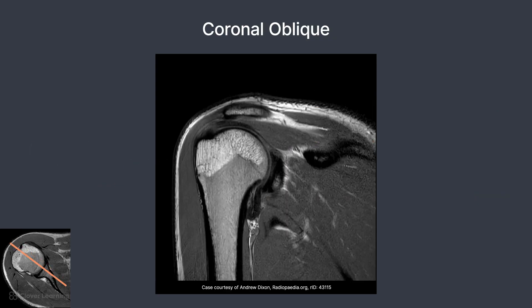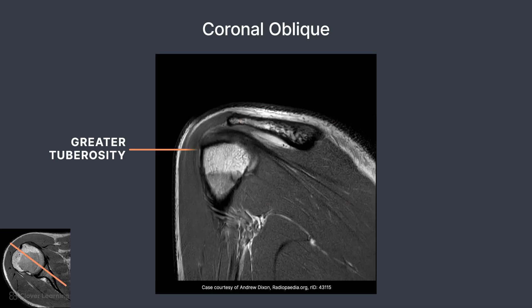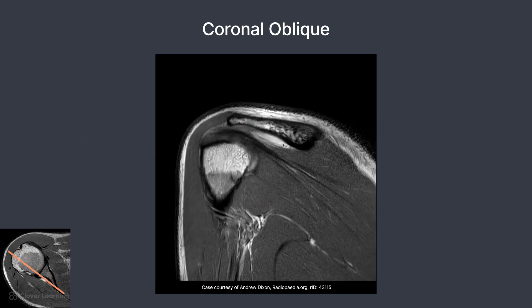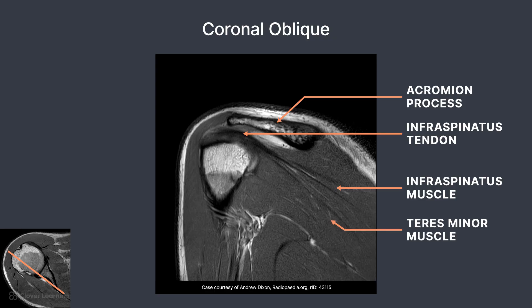At midline, we have a better view of the supraspinatus tendon. We can also see the greater tuberosity of the humerus in profile. The teardrop shape located inferior to the joint space is the axillary recess. Moving posteriorly, the angle of the acromion is visible on the superior aspect of the shoulder. The infraspinatus tendon can be seen moving from the infraspinatus muscle to insert on the humeral head. This view also demonstrates the teres minor muscle, below the infraspinatus muscle.